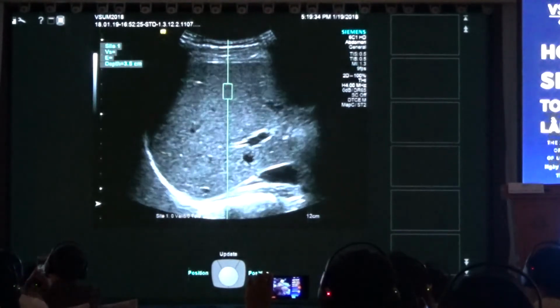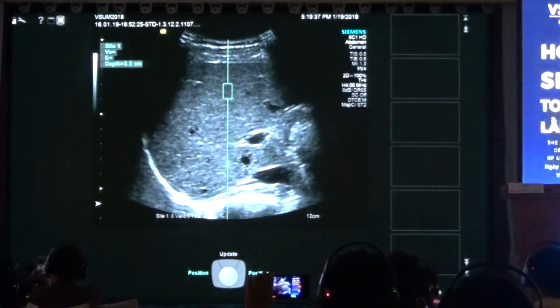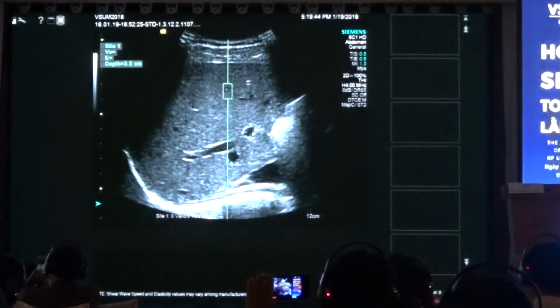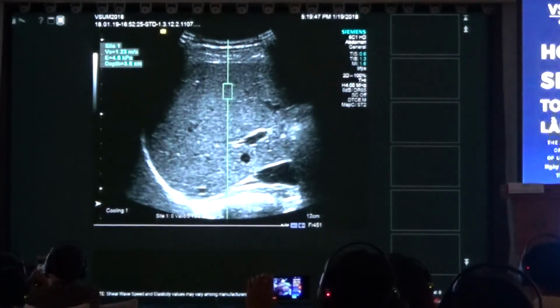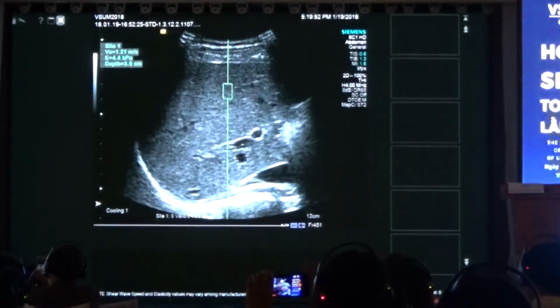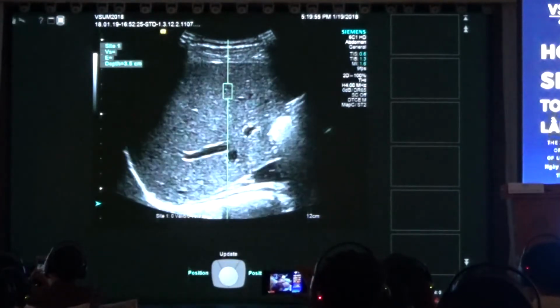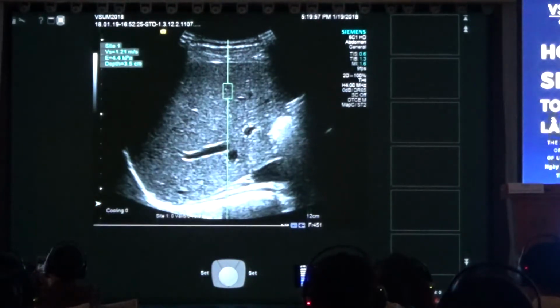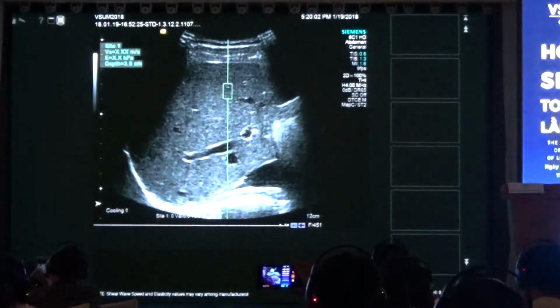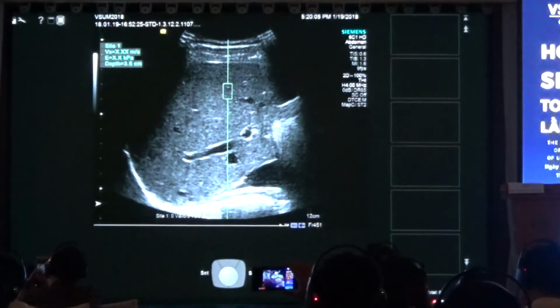measure. So the measurement will be taken, update, there will be a freeze, I defreeze, I give an update, I defreeze, I give an update, I defreeze, I give an update, I defreeze, I give an update, 5 measurements in 20 seconds. So 10 measurements will give me a time spot of about 60 seconds.